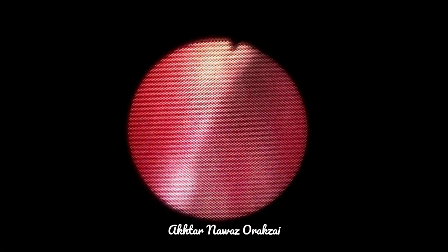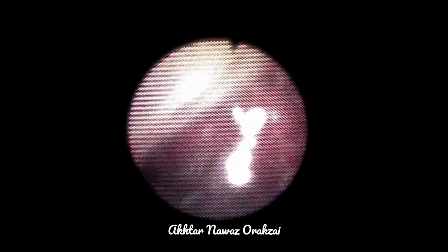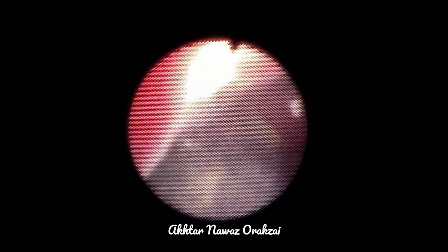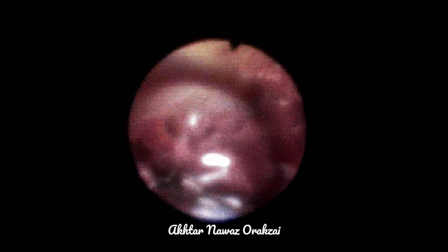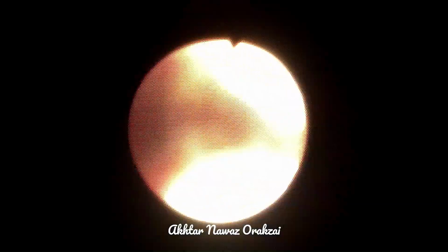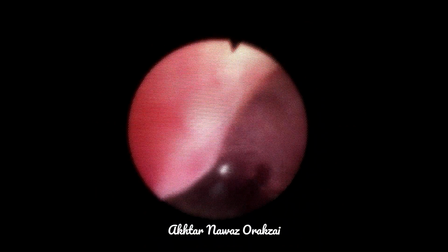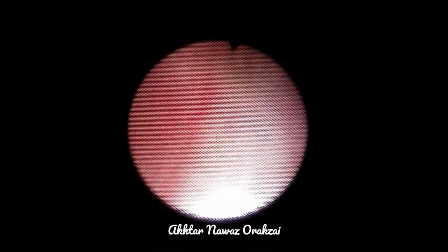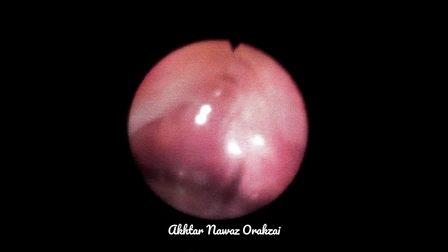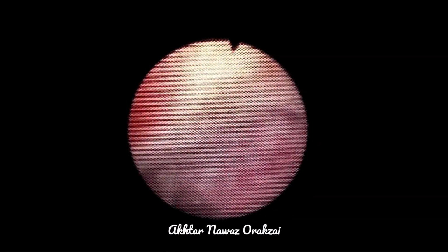Percutaneous cystolithotomy once again. These are the findings of the flexible cystoscopy. You can see that the bladder is almost full of stone. The wall of the bladder is quite different from the other patient that we discussed in the previous video. Here the prostate's median lobe is enlarged and the wall is very thick, and there are multiple trabeculations and diverticuli, albeit small ones, but they are present in the bladder.